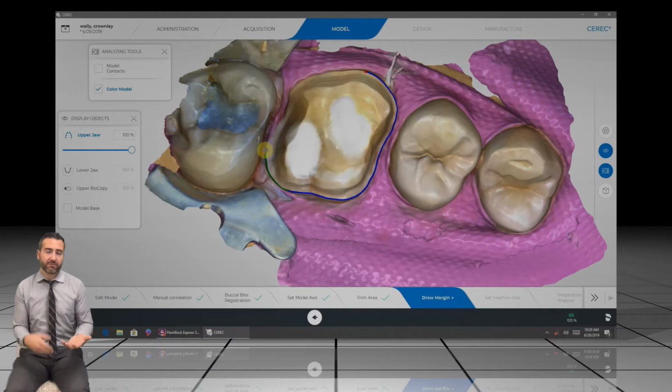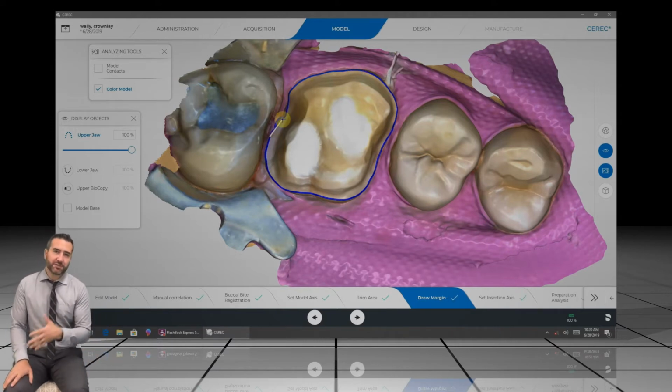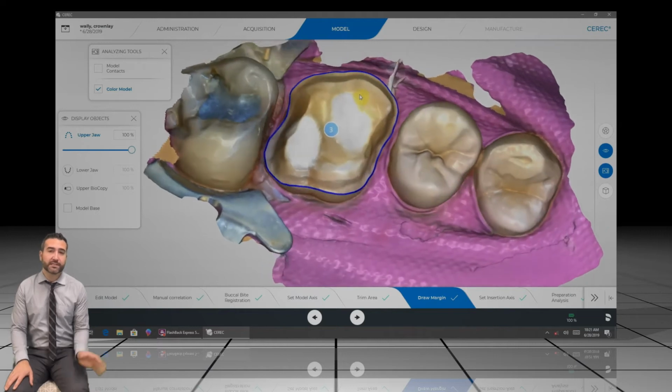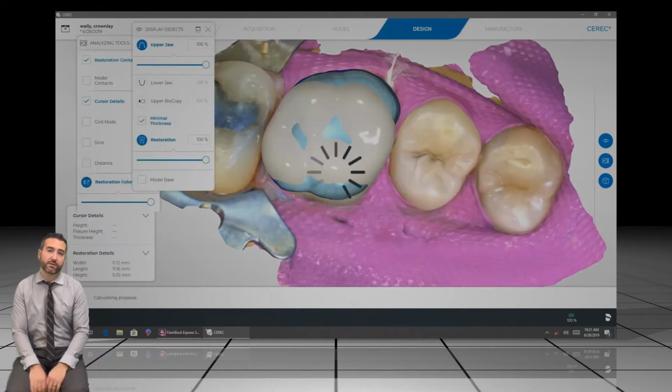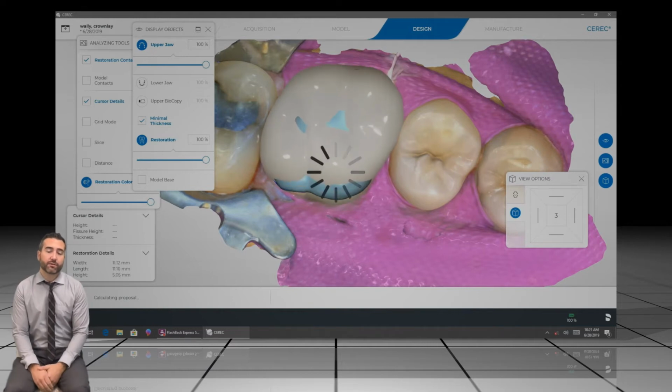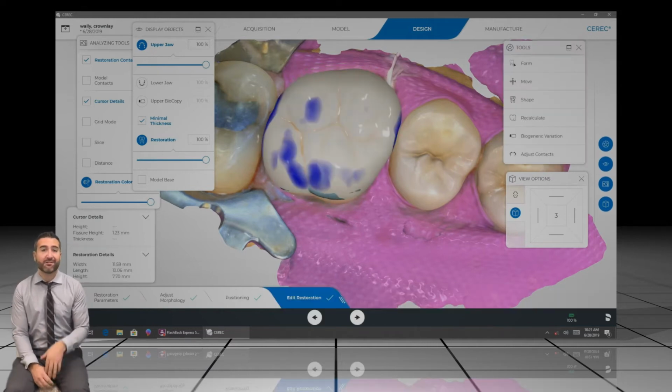A stone model or a physical impression, or something like this in full color, that you're able to see what's tissue, what's rubber dam in this instance, what's tooth, what's core buildup material. You're able to capture all that information in real time and full color and translate that information over to the laboratory so that they could go ahead and do this kind of work where they're designing the restoration digitally. They don't have to pour up models.